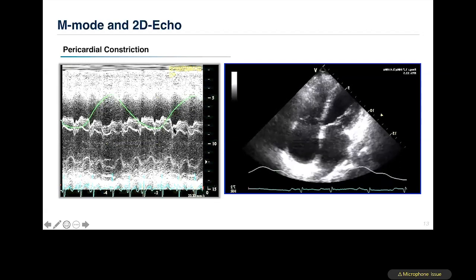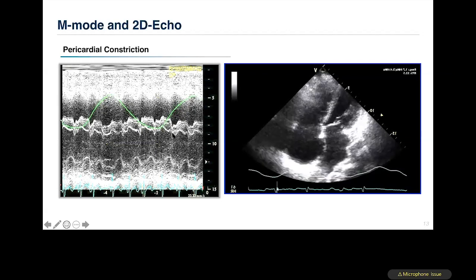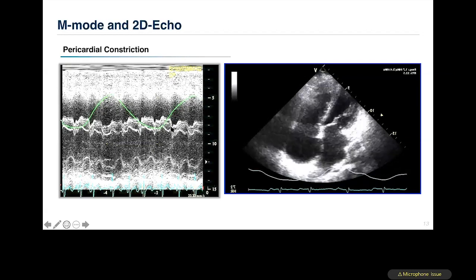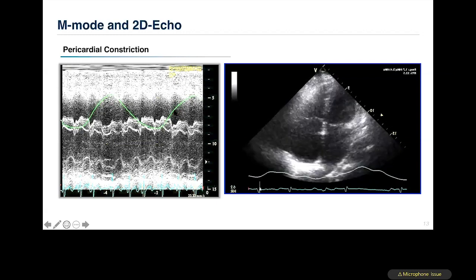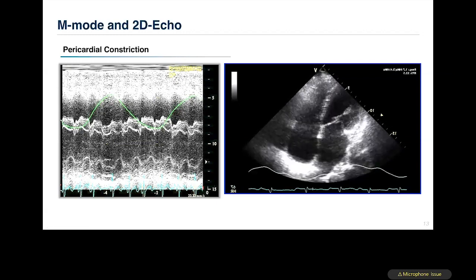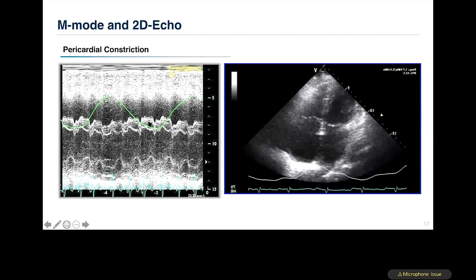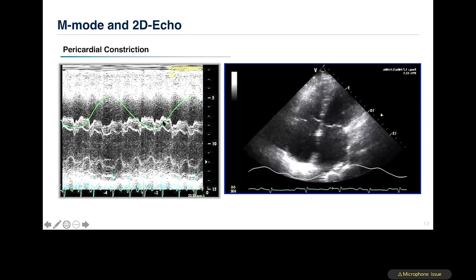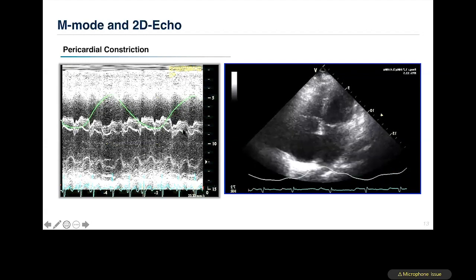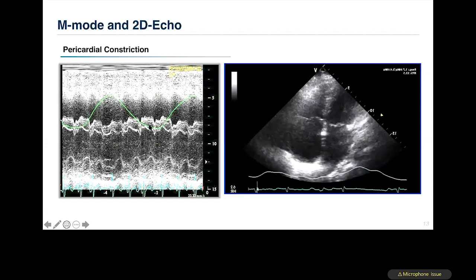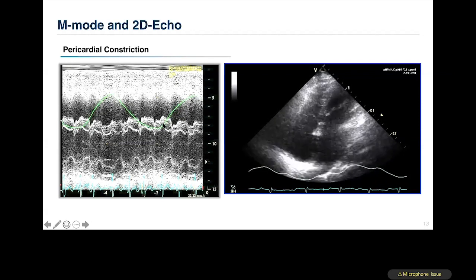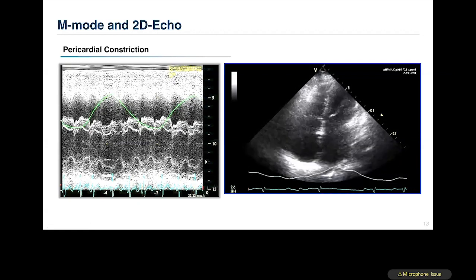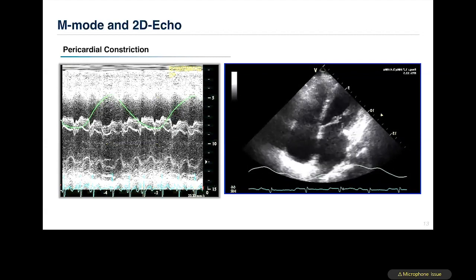The septal shudder occurs because of a large, rapid equalization of elevated filling pressure coming from the RA and LA toward the RV and LV, imparting a sudden high-frequency motion to the septum. The exaggerated interventricular interdependence in the constrained environment of a fixed pericardial volume causes the back-and-forth septal shift — a very important classic sign for recognizing constrictive pericarditis in clinical practice.